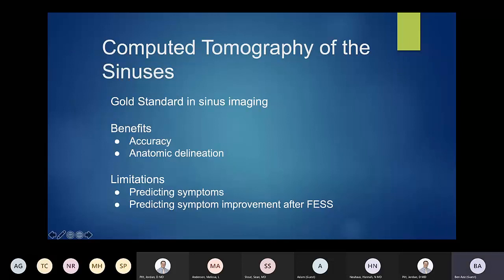CT of the sinuses is the gold standard in imaging. CT is more widely available than MR, gives a really good look at the anatomy and osseous structures — MR is not good at looking at skeletal structures, but CT is very good at that resolution. You can really see the anatomy, variations, and a solid amount of pathology including mucosal thickening and severity of sinusitis.